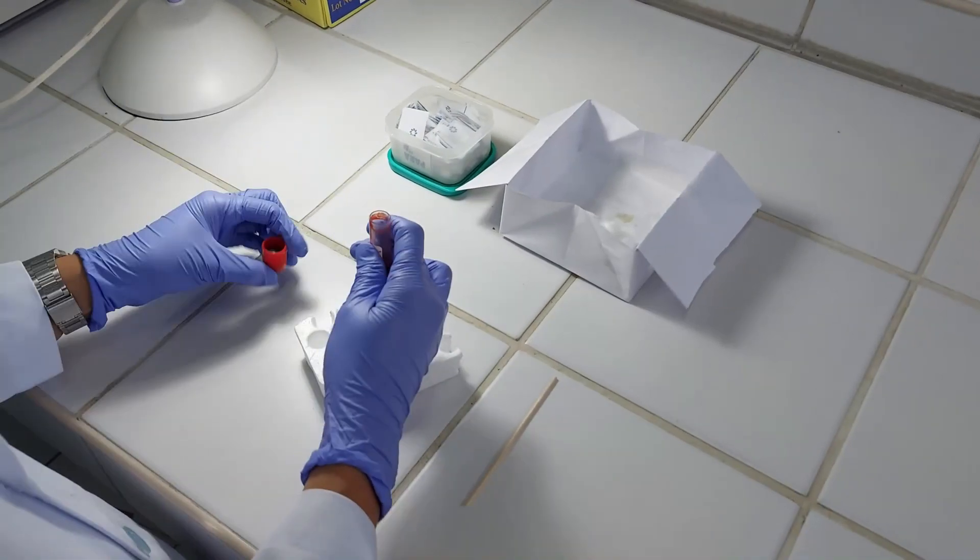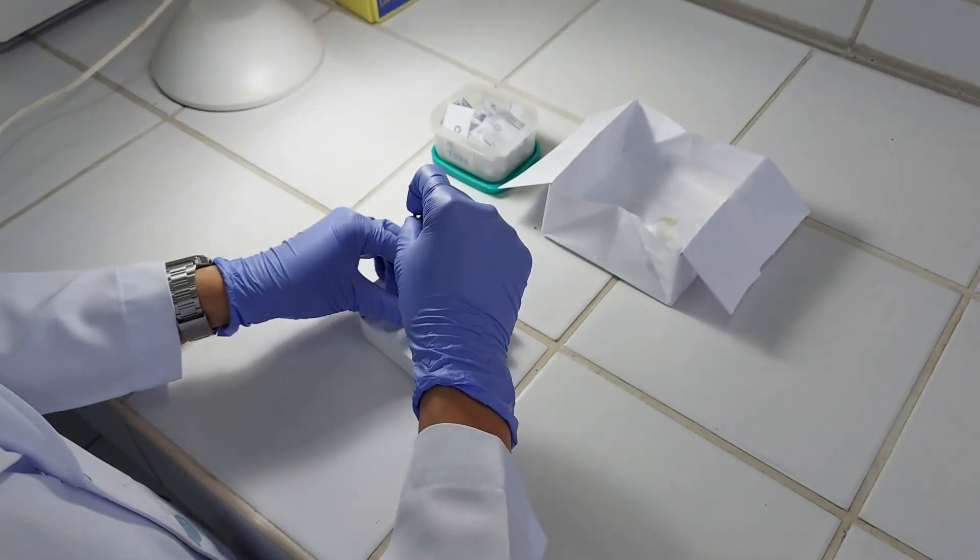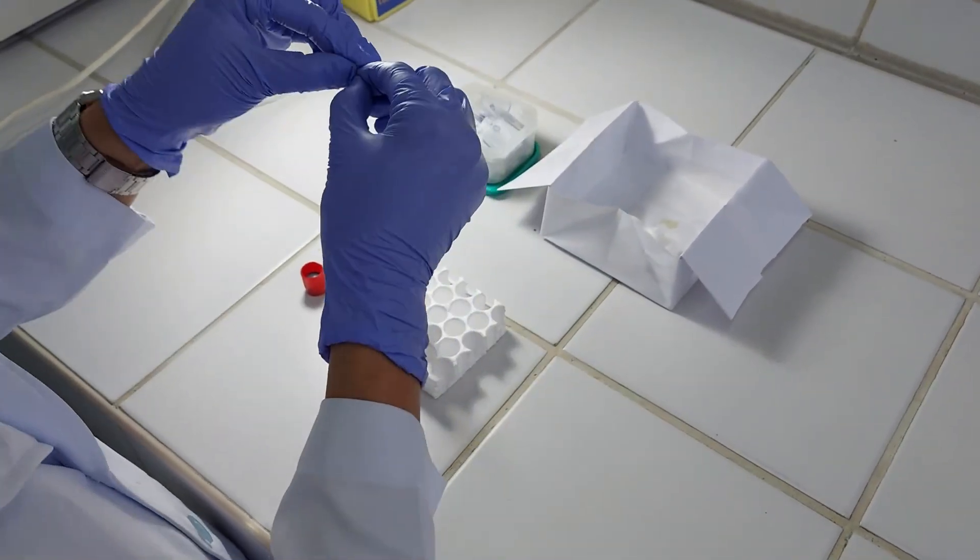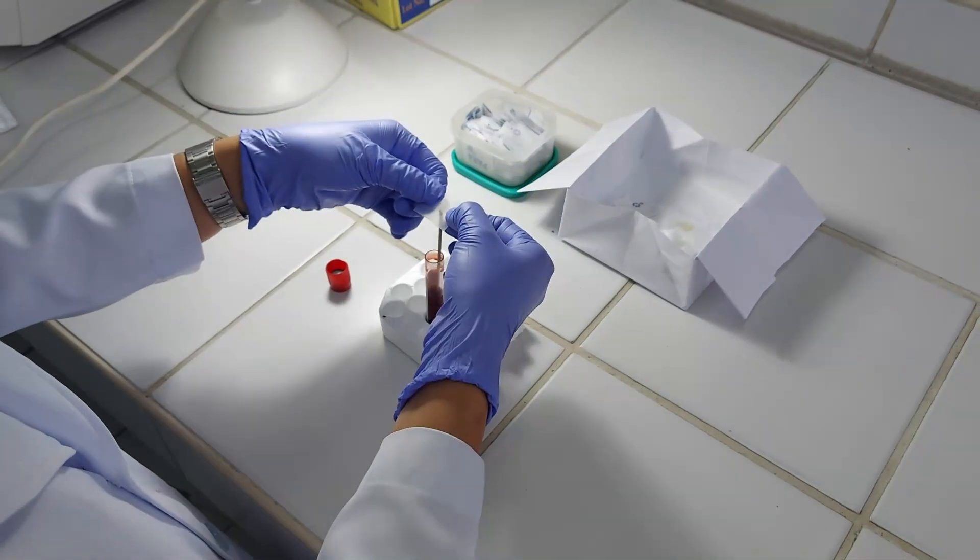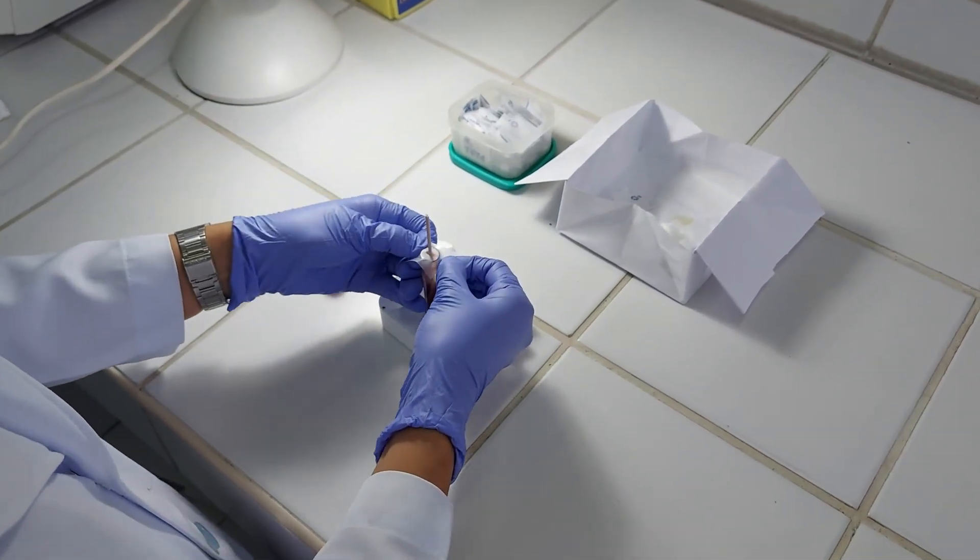The next step is to place an applicator stick or rod in the tube and cover it with a stopper. In this case, our stopper is a Nesco film to put the stick in place.